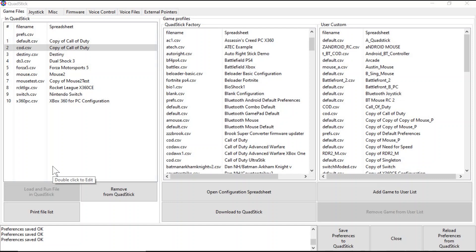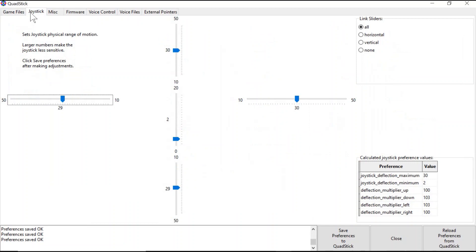I'm going to discuss some of the settings that can be changed on the Quadstick to make gameplay easier for specific users. Within the Joystick tab of the Quadstick Manager program, you can change the joystick sensitivity on the Quadstick.